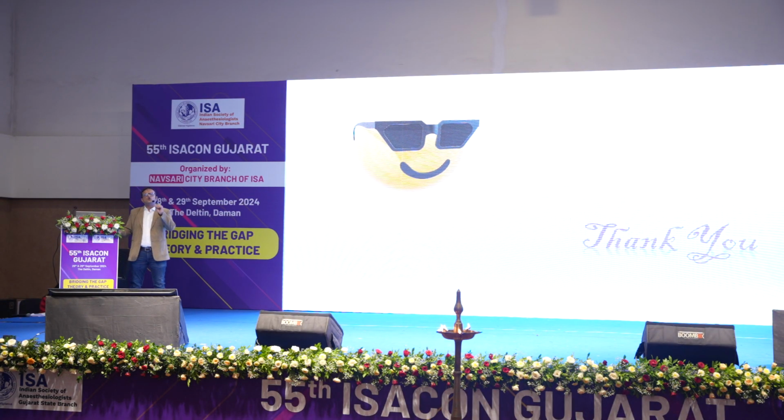ultrasonography detail. If you go with these details and you control your movement, you will keep dhairya, not me, but patience. If you keep patience and hold your probe, not haphazardly trying to find your targeted place, but just finding what you are seeing, and according to that, you try to find your desired entrance, then only can you give a very good block, and it is going to increase the effectiveness of the block. As the picture is now focused properly, your time to give the block also becomes minimal, and it can become very perfect. Thank you very much.